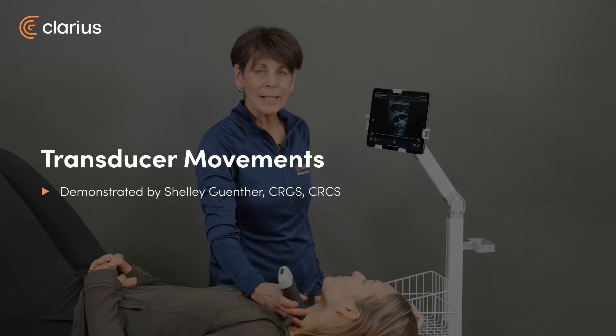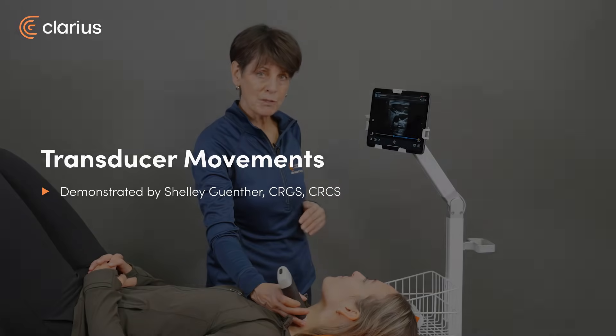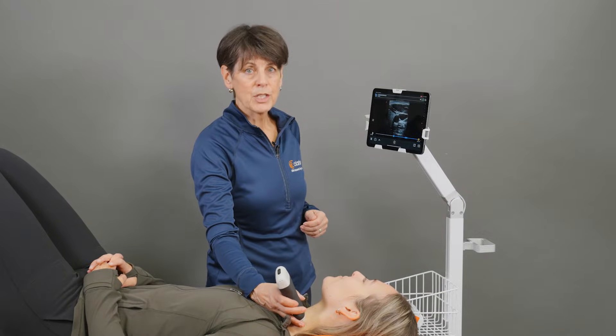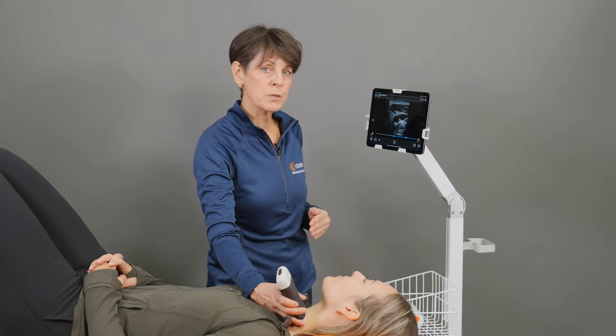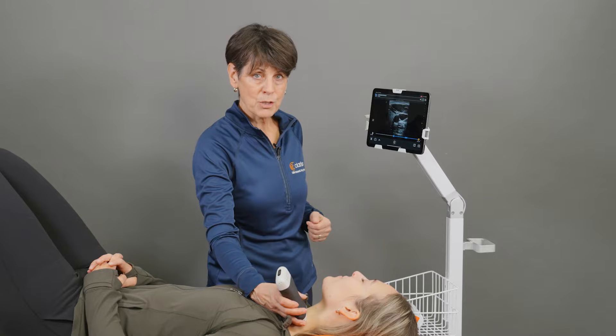Hi, my name is Shelley, and today I'd like to talk to you about basic scanner or transducer movements. You'll hear some terms in different educational sessions, so it's helpful to know what those terms are and what they mean as they impact your image.